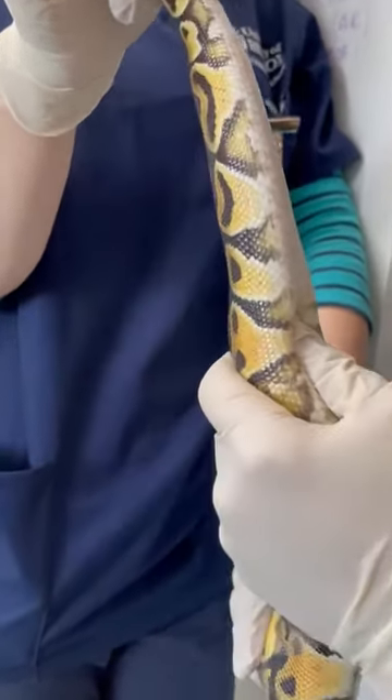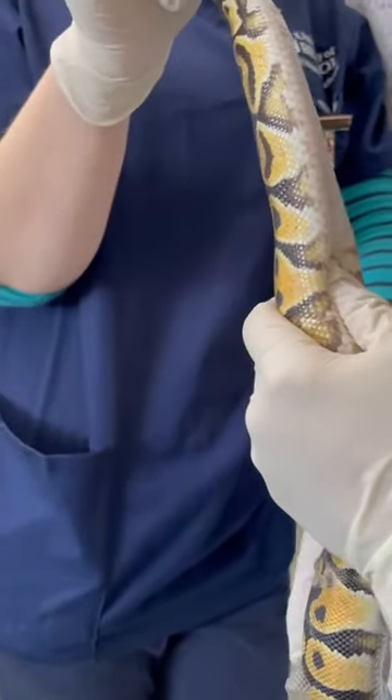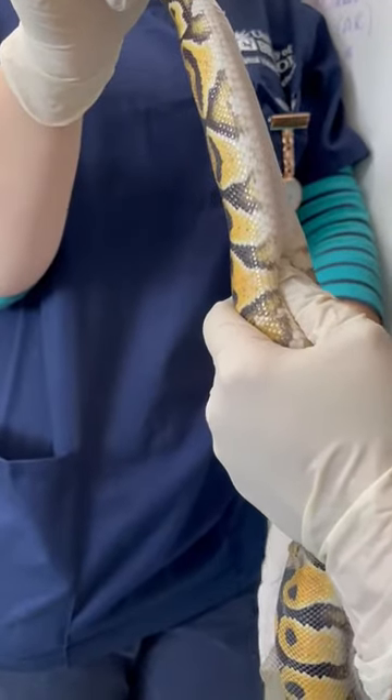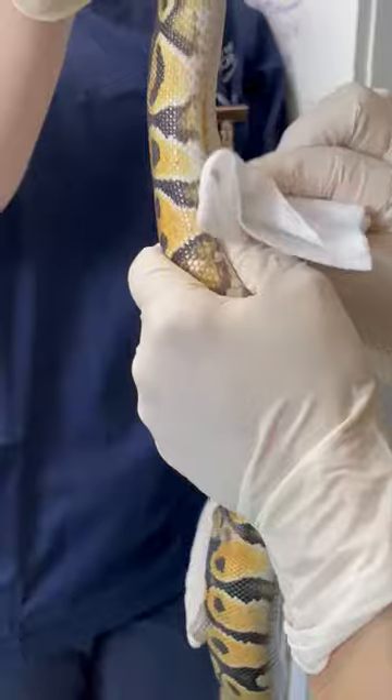You can use a Doppler or you can visualise it beating. I've just got my thumb underneath to keep it in place, because these guys can move the heart a little bit when they flinch. I then get some iodine and I'm just wiping the skin to clean it first.